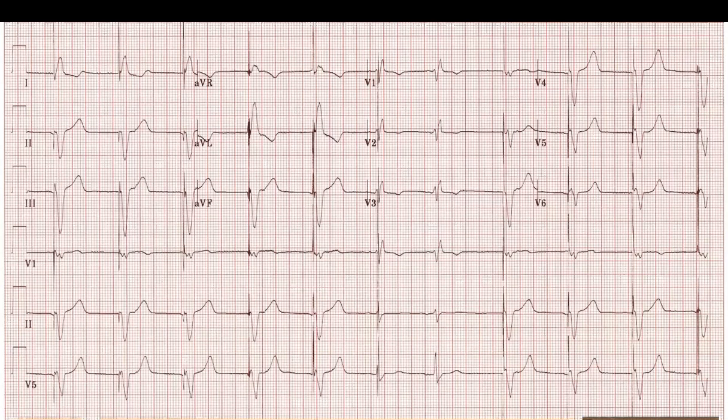Okay. Doctor, can I ask? Sure, go. The V1 shows an RBBB pattern. Is this a CRT-D? So this is not paced. Neither is this one. So I agree with you.